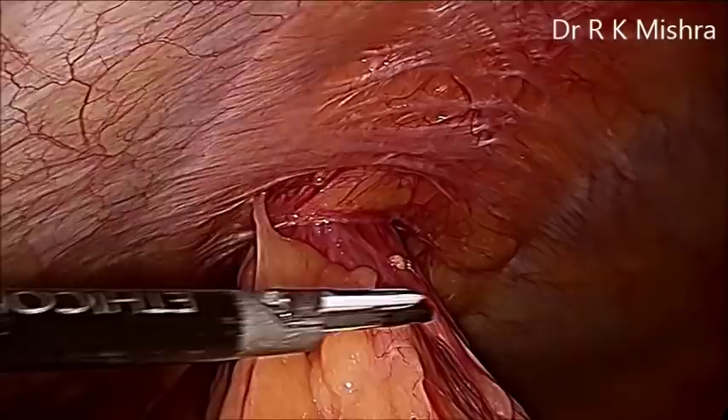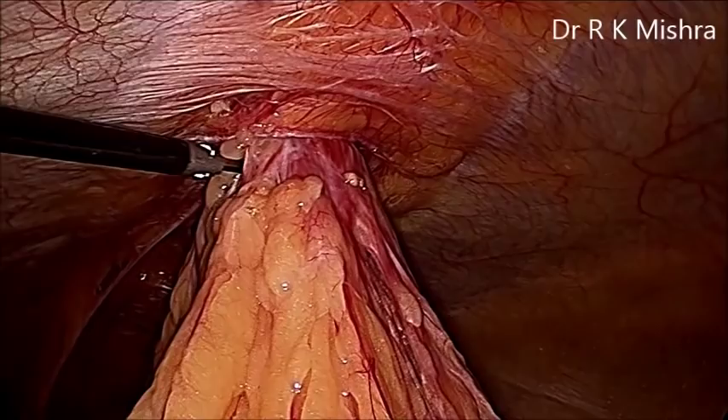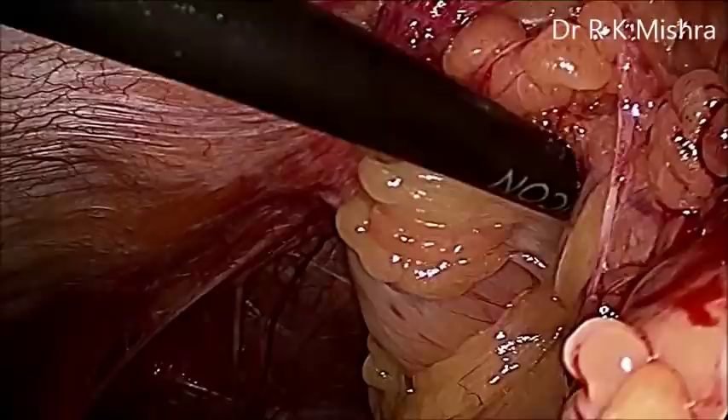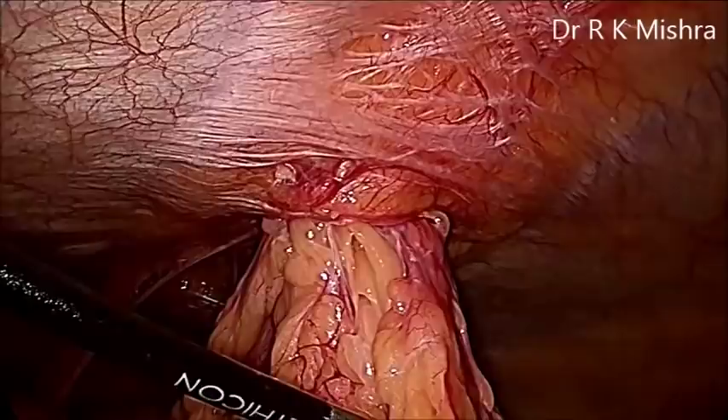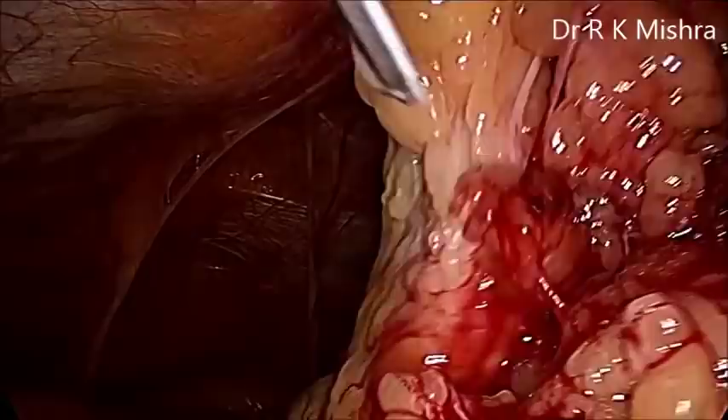It is very simple because once the omentum is there, you have to push it and try to reduce it. Although it is already incarcerated, so slowly the reduction of the content of the sac is required. You can take a small sponge on the left hand and try to press it down with the finger. Gentle blunt dissection can be performed. If required with the harmonic, you can dissect some of the omentum also, so that once the neck is released, the remaining fat will come out.